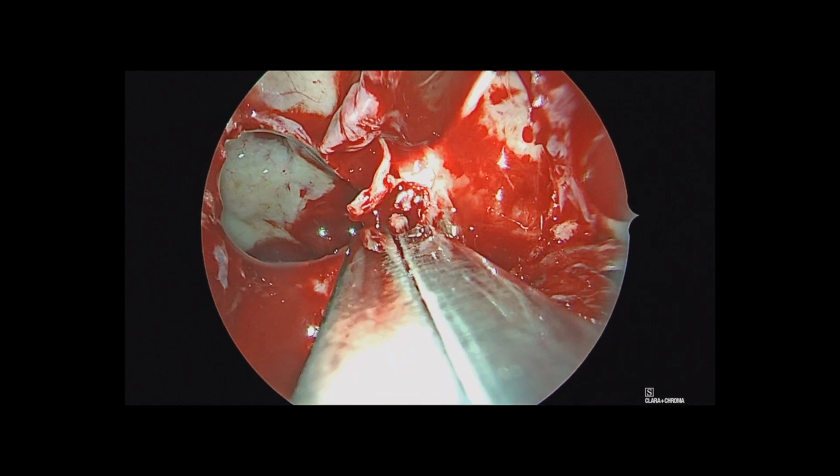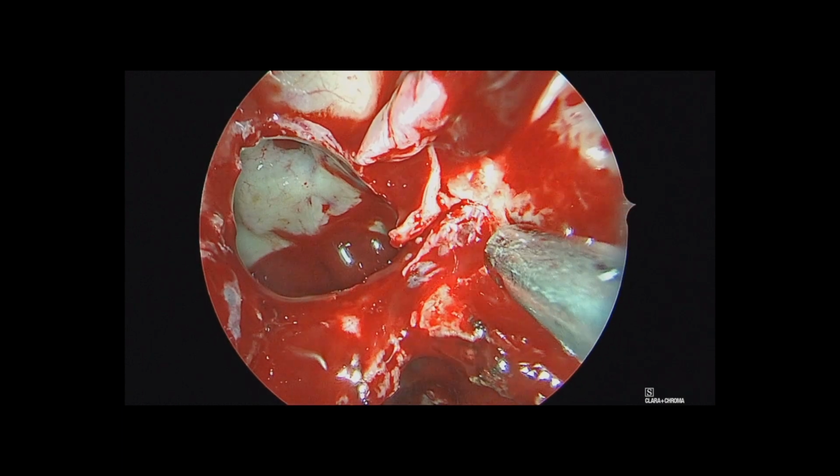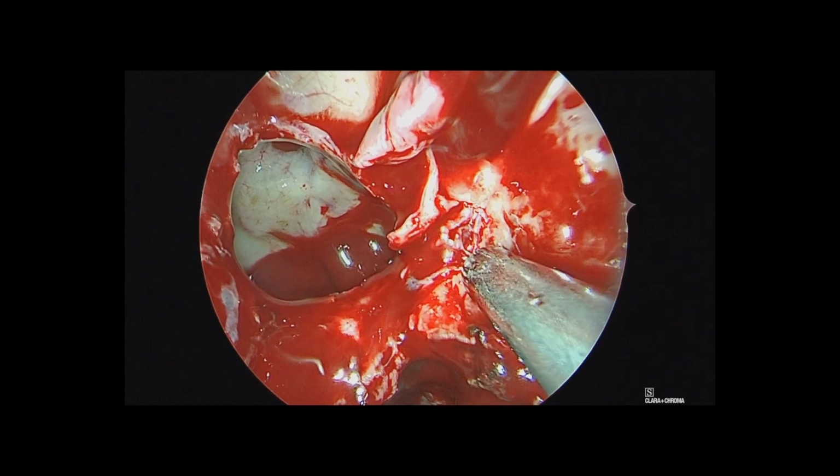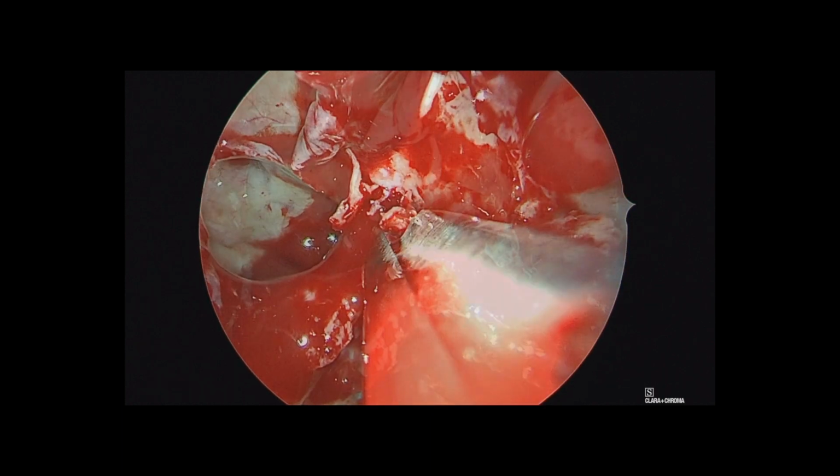We continue to take down the bone of the posterior aspect of the maxillary sinus, exposing the pterygopalatine fossa. And again, you see a little bit of bleeding here from the artery, which we'll take care of with bipolar cautery here.